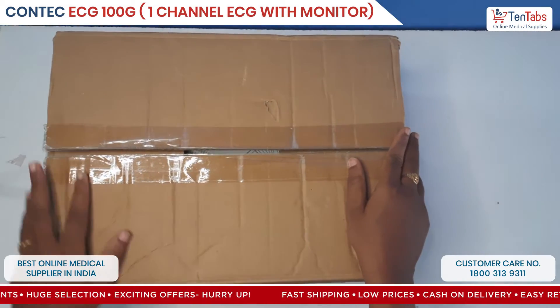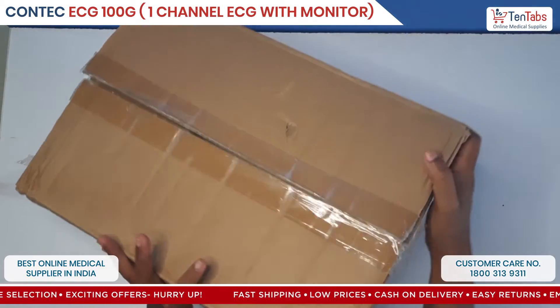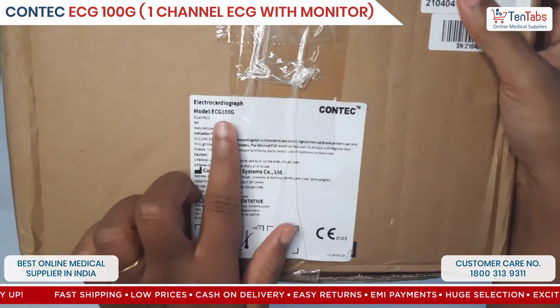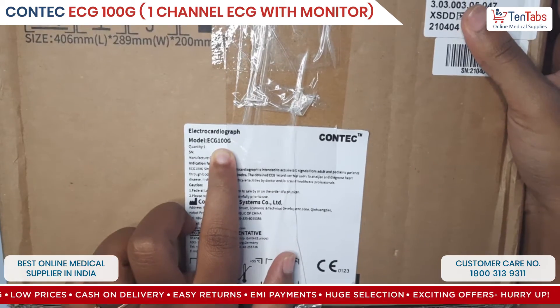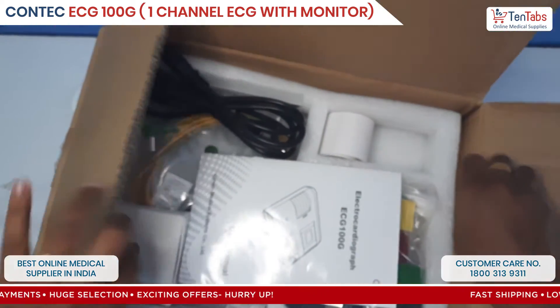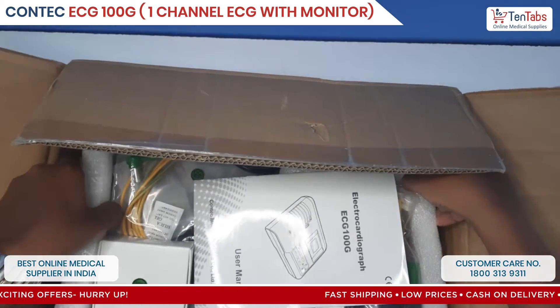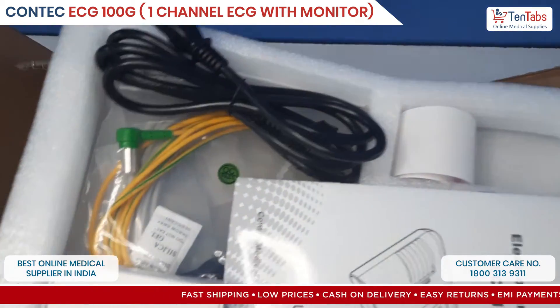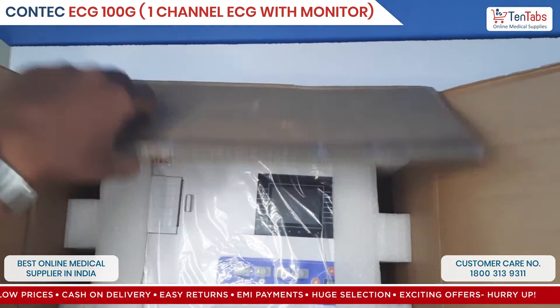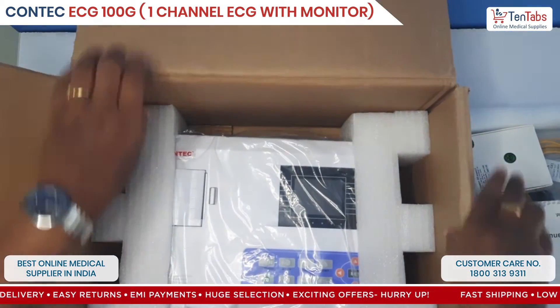Hi guys, today let's see an installation and unboxing video of the KONTEK ECG machine, which is a single channel 100G. Firstly, the unboxing — here you can see all the standard accessories in the box, and this is the ECG machine.